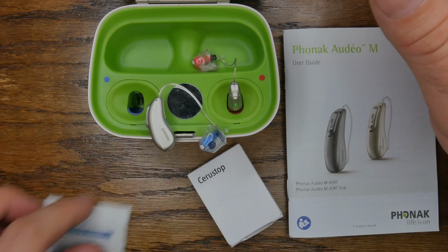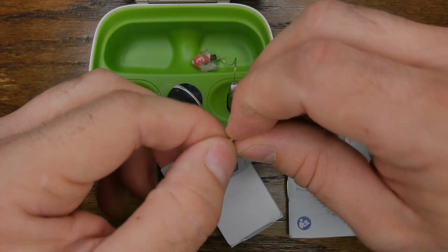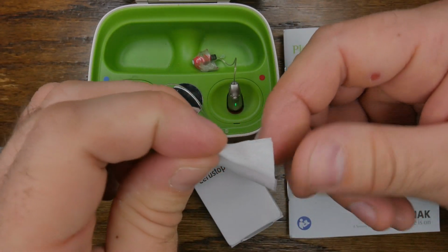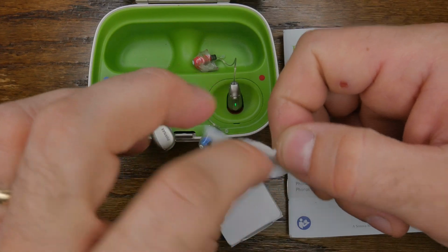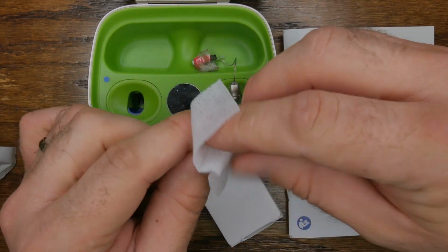For more aggressive cleaning, wiping down the devices with a tissue or alcohol prep pad, as shown, can both disinfect and clean stubborn wax and debris from the hearing aid with greater ease. It is important to wipe down the main body of the hearing aid in order to remove debris from the microphone ports as shown.